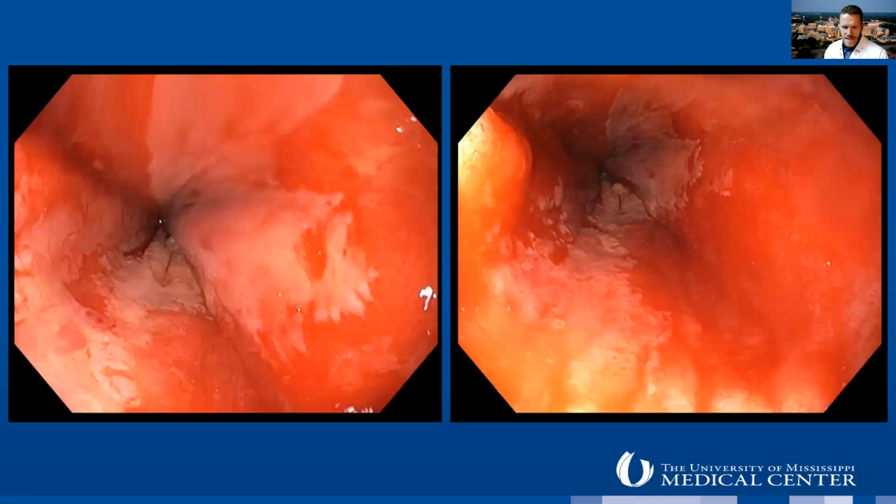And here you see the good freeze being deployed, and then as is not uncommon, the screen beginning to freeze up at the very tail end as you finish your freeze. And then this is what we see afterwards. This is the effective good cryoablation.